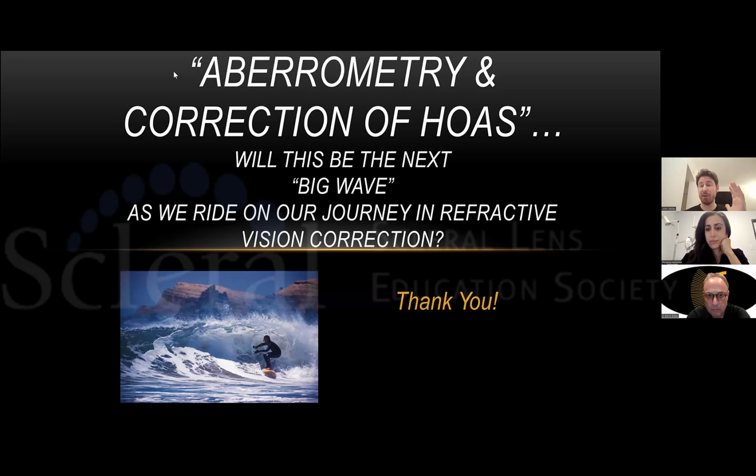It'll tell you, here's the front surface aberration, but here's the posterior corneal surface aberration as well. And if you had a non-integrated system, let's say an individual tomographer and then a standalone aberrometer, you could look at those and say, okay, here is the contribution from each of those surfaces, and the total eye, and you could estimate that on your own, but that's going to be a tough thing because the calculations are very, very sophisticated.